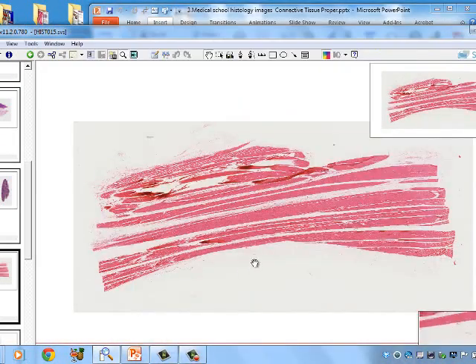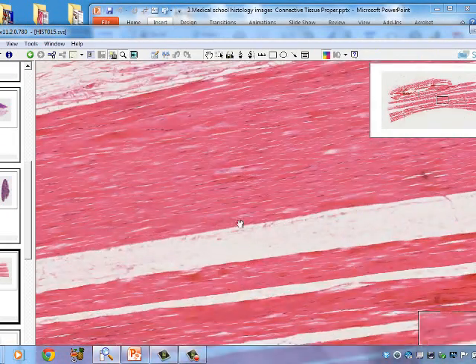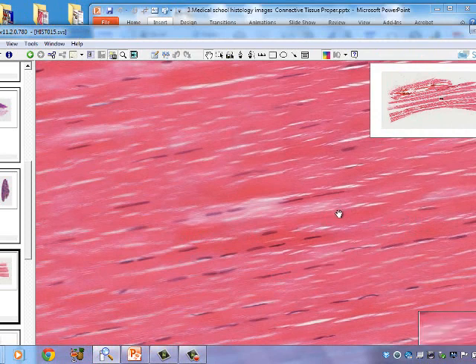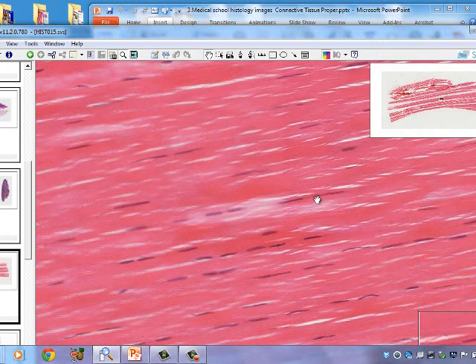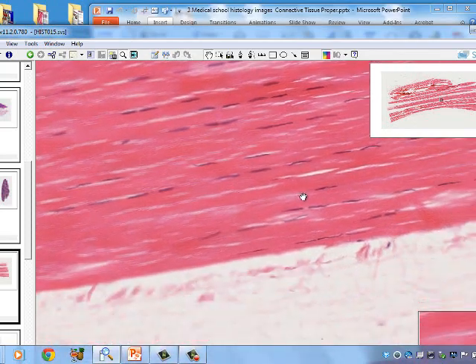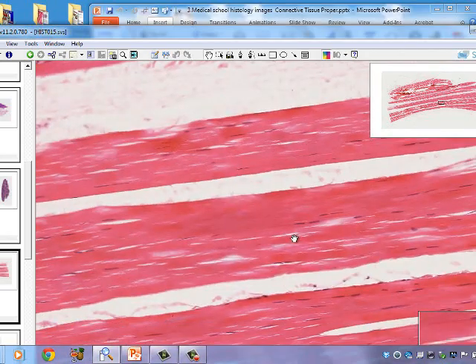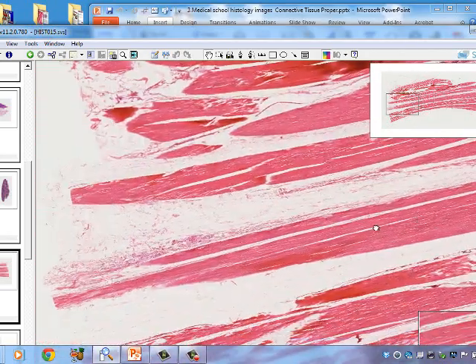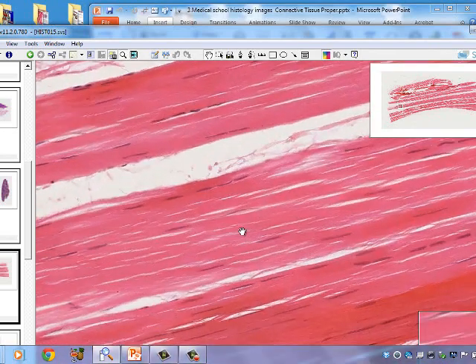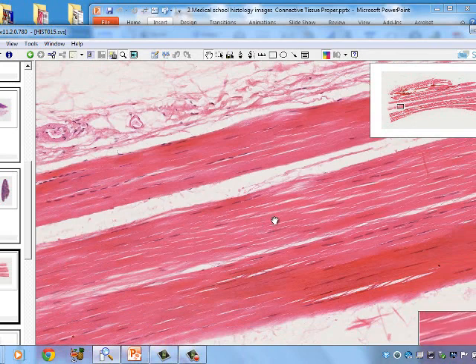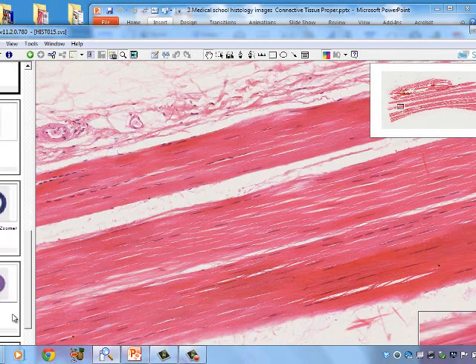This is slide 15 — a tendon. The collagen bundles all run in one direction. The blue nuclei of the cells are visible, and between them is a large amount of pink extracellular matrix. While it's difficult to make out the individual cell boundaries, you can see the nuclei and the extracellular matrix arranged in a linear, regular fashion — hence: dense, because many fibers; regular, because they're aligned; with few cells.